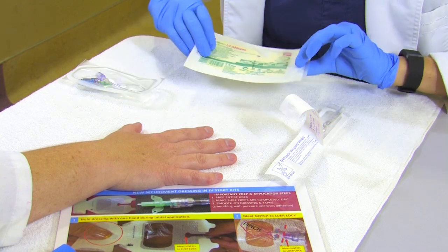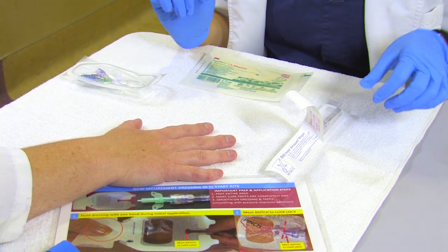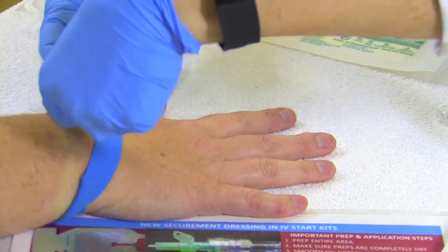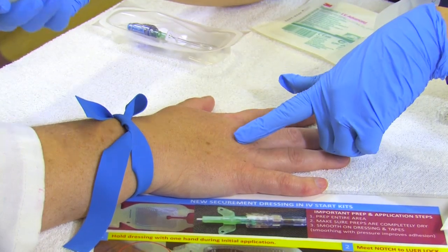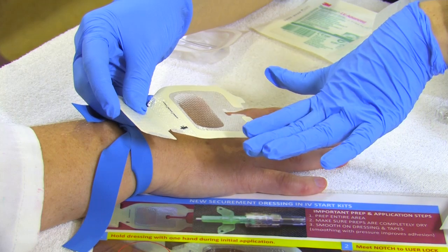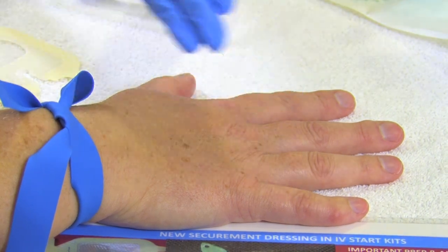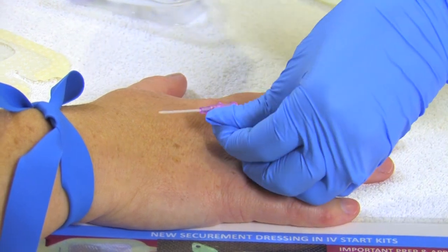Okay, so in your normal sterile fashion at the bedside, we're going to start an IV. We're going to look for our IV. After you find your vein, you want to eyeball the area because you want to clean the entire surface under the dressing and off to the side, where we're going to put our tape to secure the J-loop, and you want to make sure that it's clean and prepped and completely dry before you start. So I've found my vein and I've inserted my catheter.